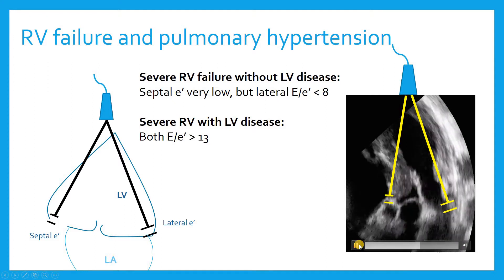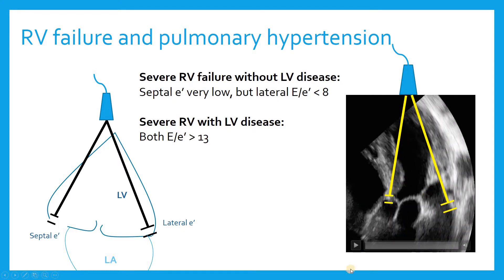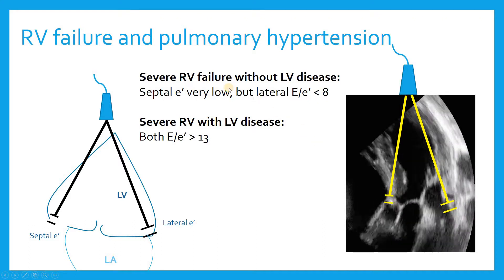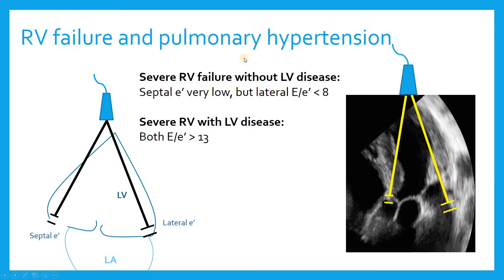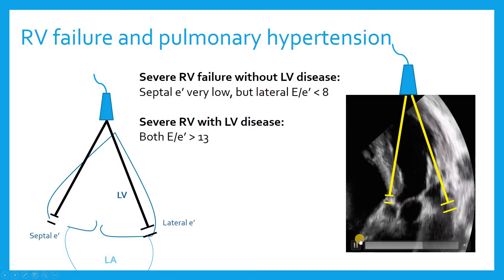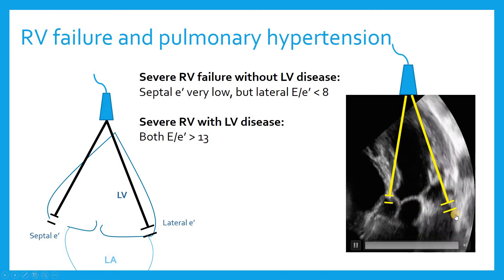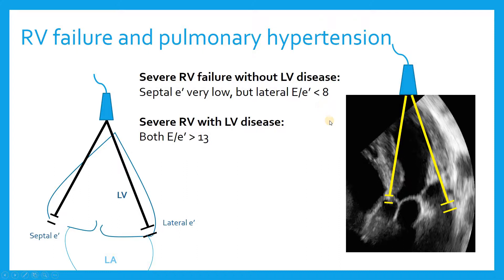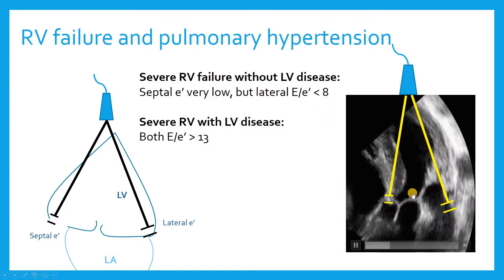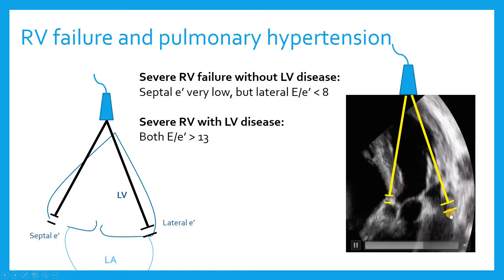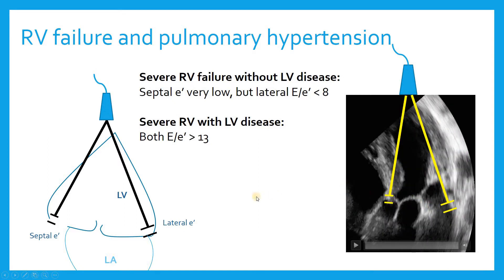This is a parasternal short axis turned on its side to illustrate the concept of distinguishing whether pulmonary hypertension and RV failure are due to left heart disease. One of the best ways to distinguish that is to look at both your septal and lateral E prime velocities. When patients have severe right ventricular failure without left ventricular disease, the septal E prime will be very low, but lateral motion will still be preserved and your lateral E-to-E prime will be normal, suggesting left atrial pressure is normal. This patient had both lateral and septal E primes that were low, and the E-to-E prime ratio was greater than 13, so I concluded this patient had more of a left ventricular cause of their pulmonary hypertension — a diastolic failure type physiology.